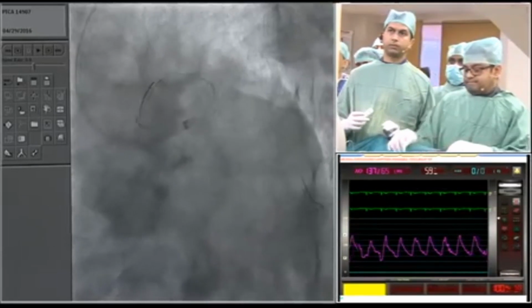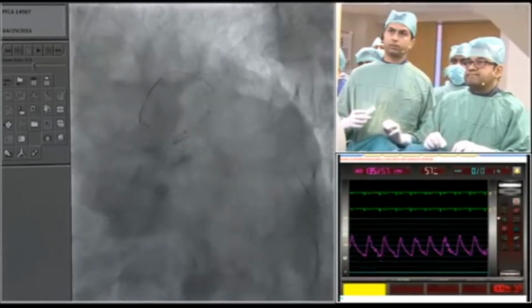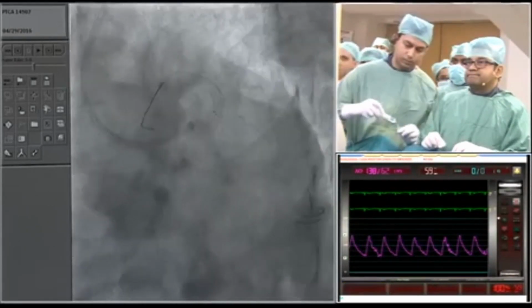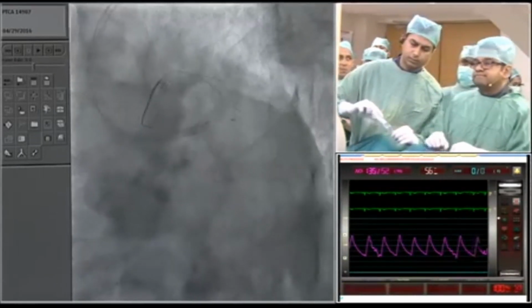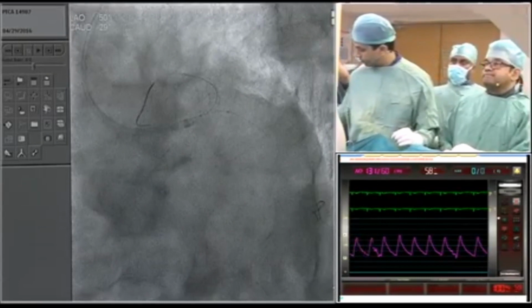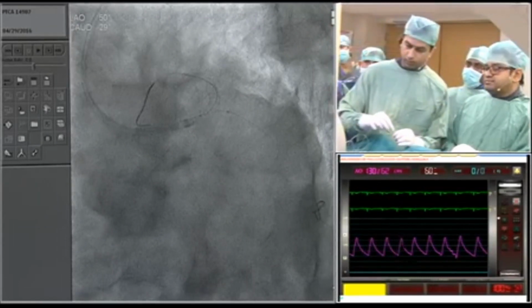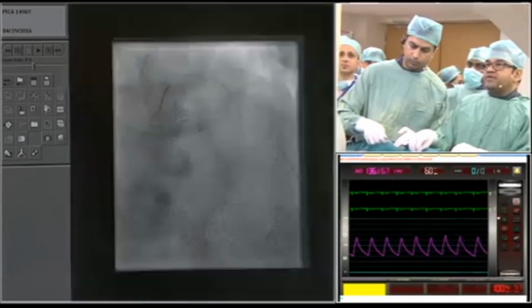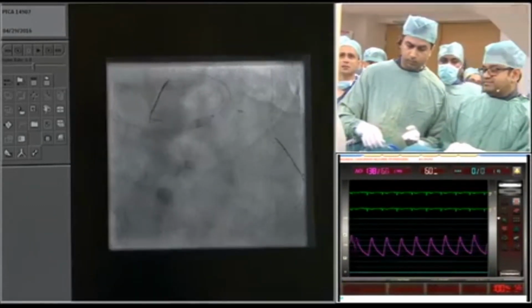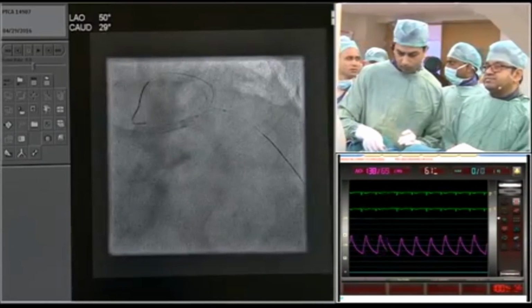You can see with this clear stent or stent enhancement system if you have a deformation of the main stent. So what is the size of your balloon, Dr. Kumar? What is the size of your balloon, the diameter? 2.5, 2.5. It's 2.5, okay, thank you.